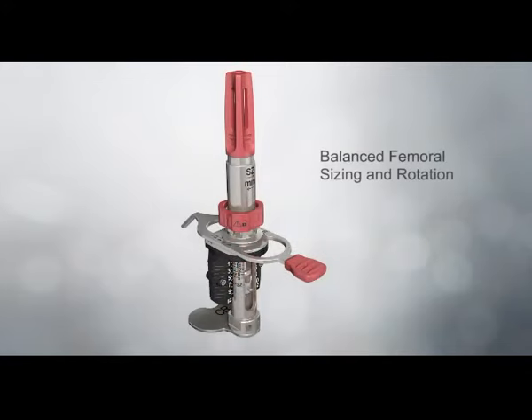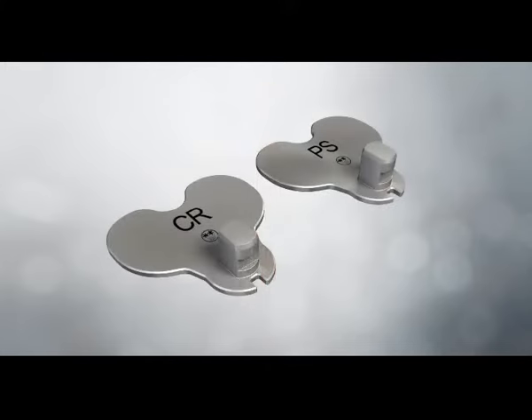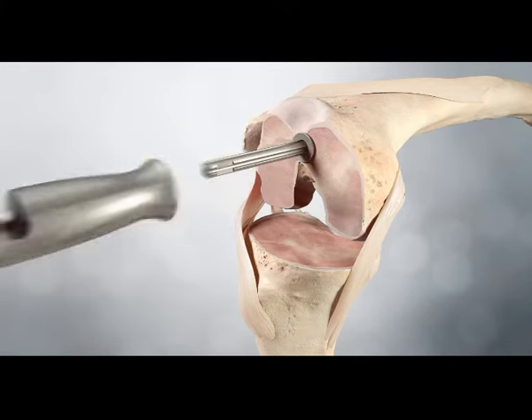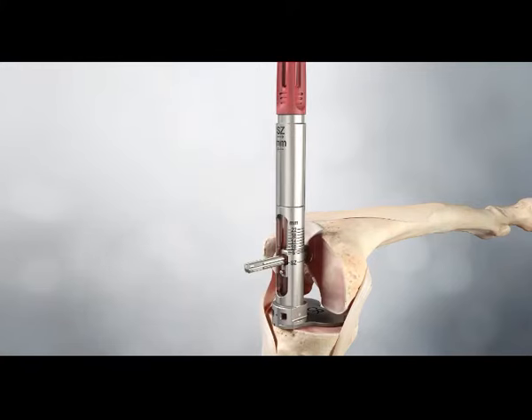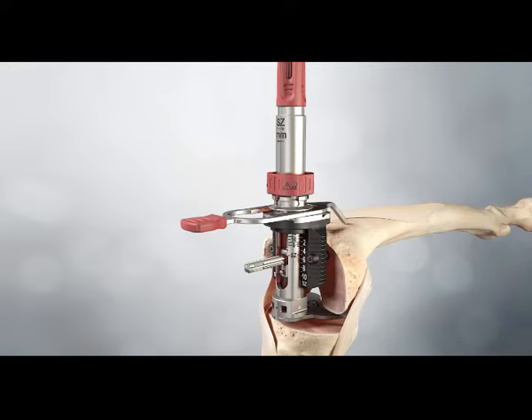Balanced femoral sizing and rotation. The balanced sizer sizes the femur, sets rotation of the femur based on ligament tension, and enables assessment of the flexion gap in comparison to the previously determined extension gap. To accommodate differences in flexion gap assessment between cruciate retaining and posterior stabilised implants, the appropriate foot is attached to the balanced sizing rotation guide. After the extension gap is determined and recorded, the IM rod is inserted into the intramedullary canal and the tapered plug secured tightly. With the knee flexed at 90 degrees, the balanced sizer slides onto the IM rod with the feet clearing the posterior condyles. The tensioning knob is turned counterclockwise in the direction of the size arrow until the sizer foot contacts the condyles and the sizer is unable to rotate on the rod. The guide and stylus slide over the main body of the sizer until the stylus touches the anterior femur.